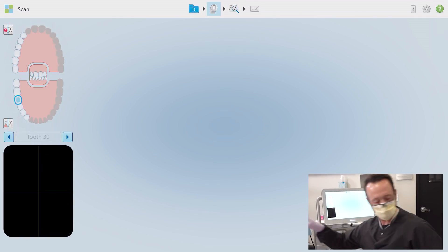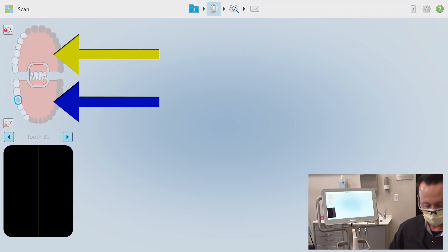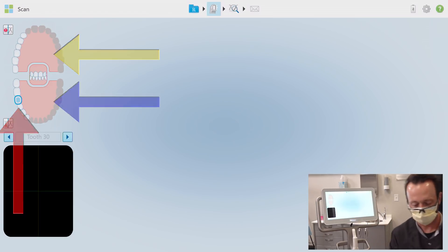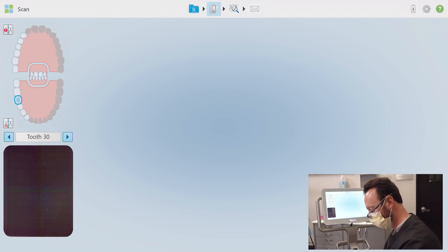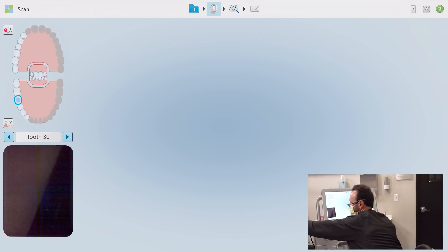I have a few selections to choose from as to where I'd like to scan first — I could begin with the opposing arch, the working quadrant, or even the actual tooth preparation. Even though the unit will let you start at any of these options, always always start with the individual preparation scan and build out from there. All this work we've put into tissue retraction and hemostasis needs to be taken advantage of immediately.